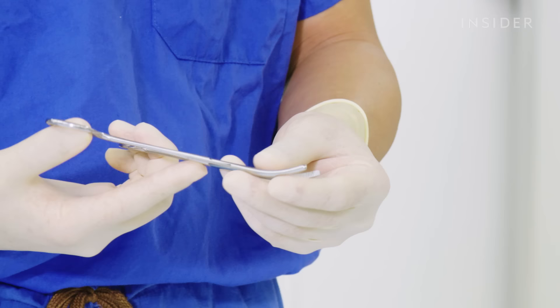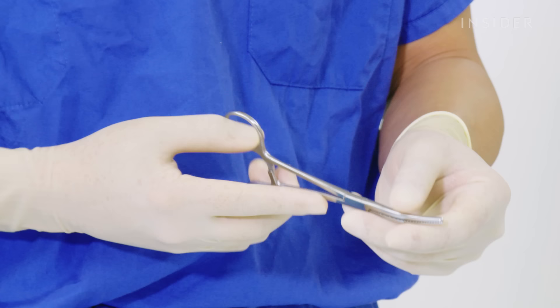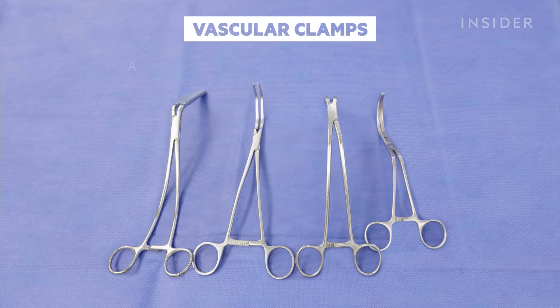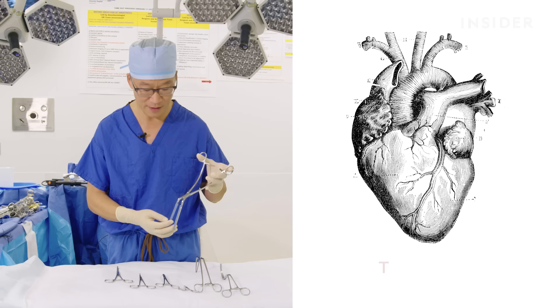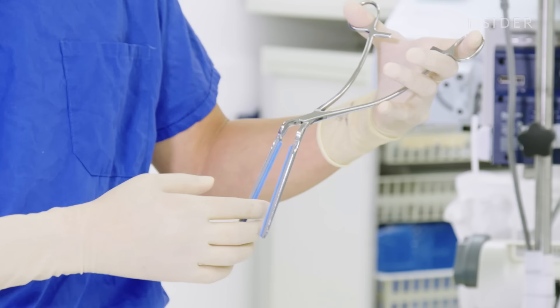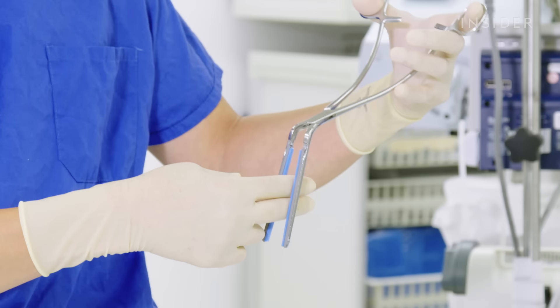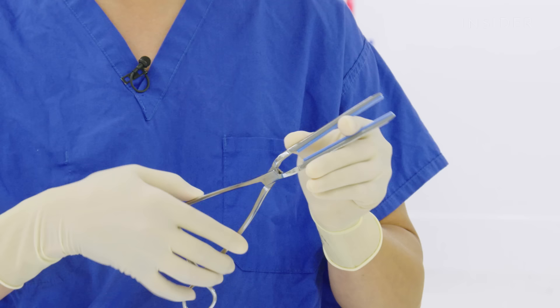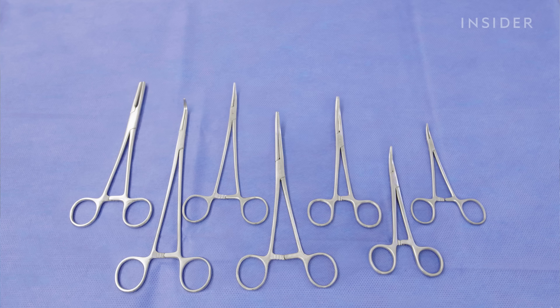The other clamps don't have that specialty, so we use these often to hold suture or to hold areas that we are not as concerned about maintaining the viability of the cells. So this is our aortic cross clamp. The aorta is the big blood vessel off the top of the heart that feeds blood to the entire body. It's about three centimeters across and is used to occlude that blood vessel at the time of surgery. If you imagine my fingers being the aorta, the clamp would be placed completely across the aorta and clamped so that there's no blood flow.